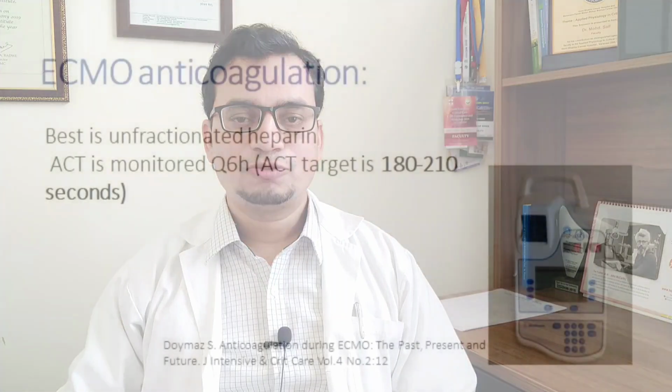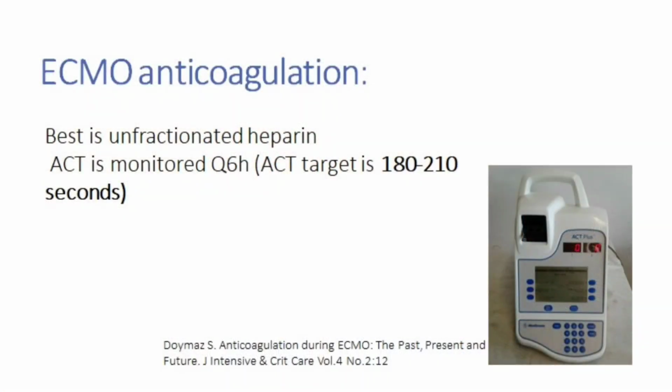To prevent this complication, a calculated and corrected level of anticoagulation is required, which is provided by unfractionated heparin infusions, which remains the predominant anticoagulation agent during ECMO. The infusion dose is titrated to an activated clotting time of 180 to 210 seconds.